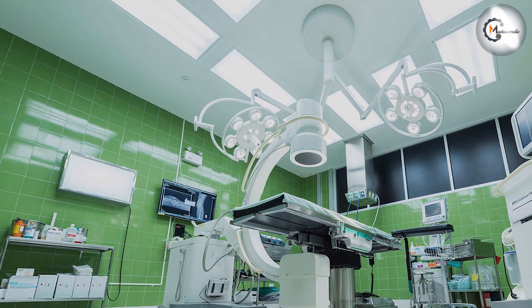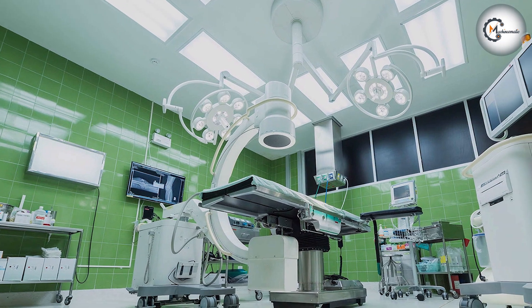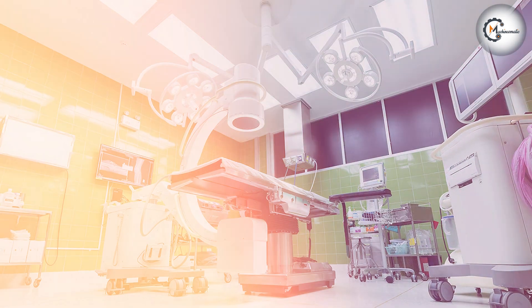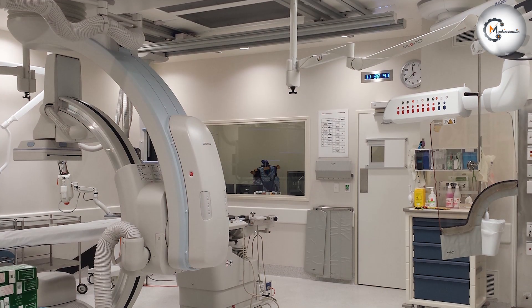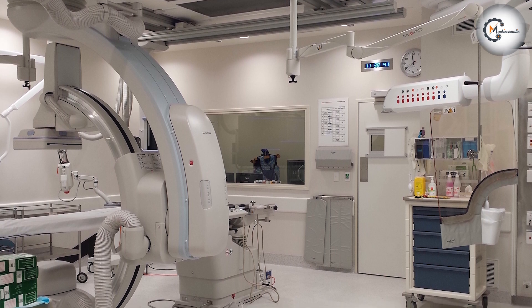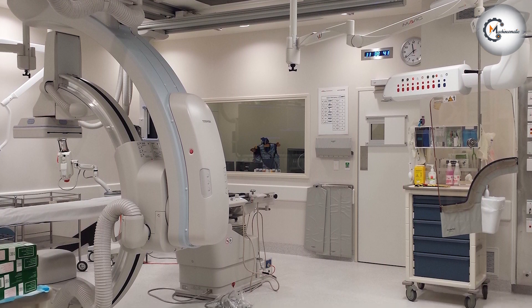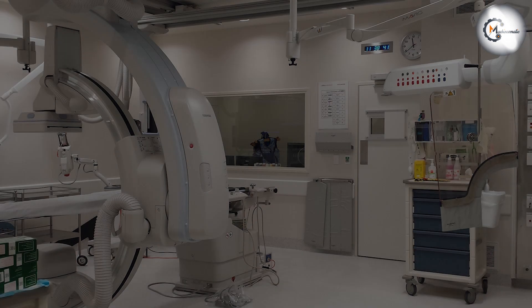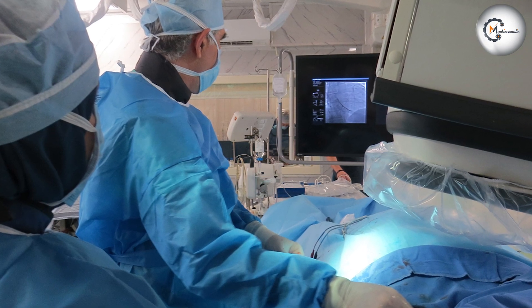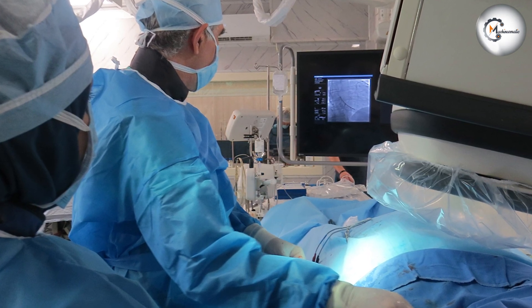On the other hand, the angiogram machine is a more invasive procedure, but it is generally more accurate than the cardiac CT scan. It can also be used to perform other procedures, such as angioplasty or stenting, which can help to clear any blockages found during the procedure.